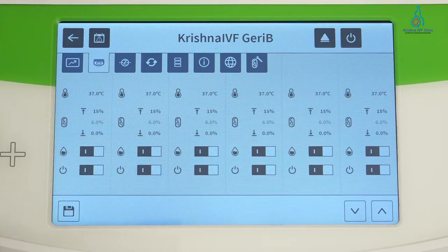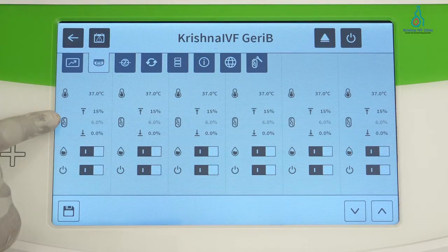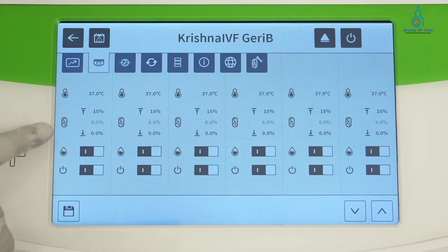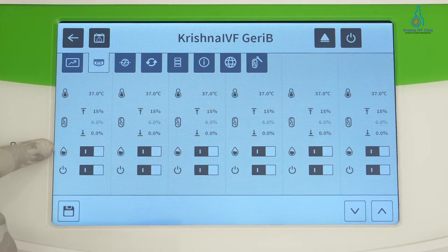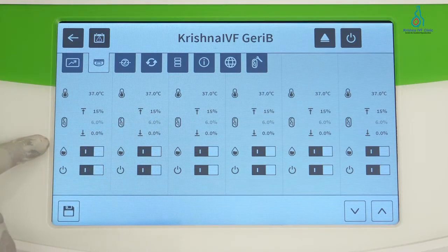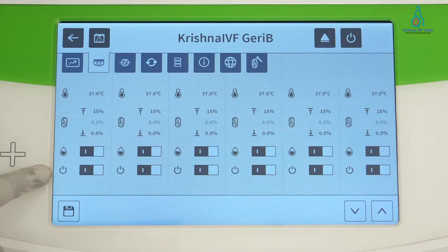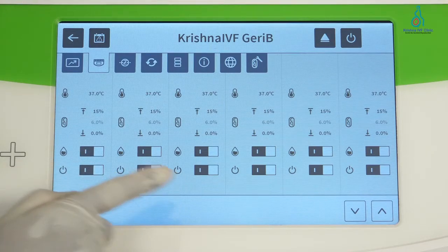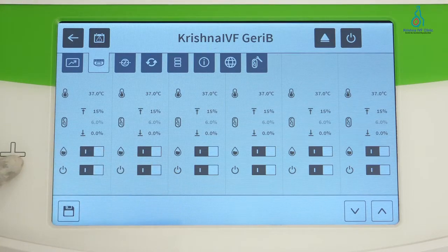The second section is settings for each chamber. Here it shows temperature, CO2, and humidity, along with an on/off switch for each parameter and a chamber on/off switch. If we are not going to use any of the chambers, we can turn that chamber off.